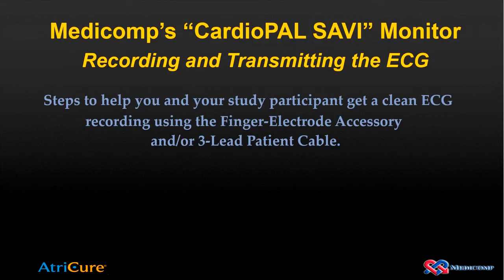This slide set will take you step by step through making a recording and then transmitting it. So your knowledge and familiarity with these processes will be extremely helpful to you and your patients when it comes time to train them to do the same things you are about to do. Also, you can practice these steps anytime you want. Just make sure that you reset the monitor before you give it to the patient. We'll go through the reset sequence at the end of this segment.